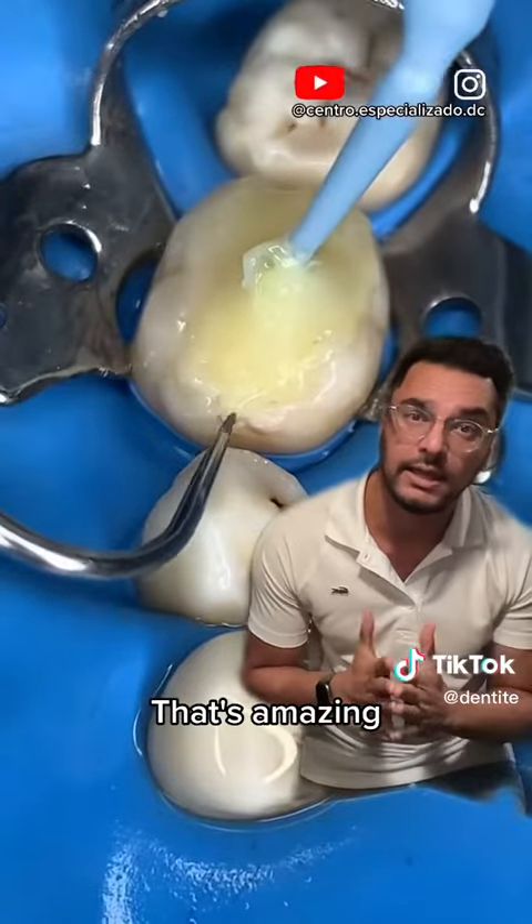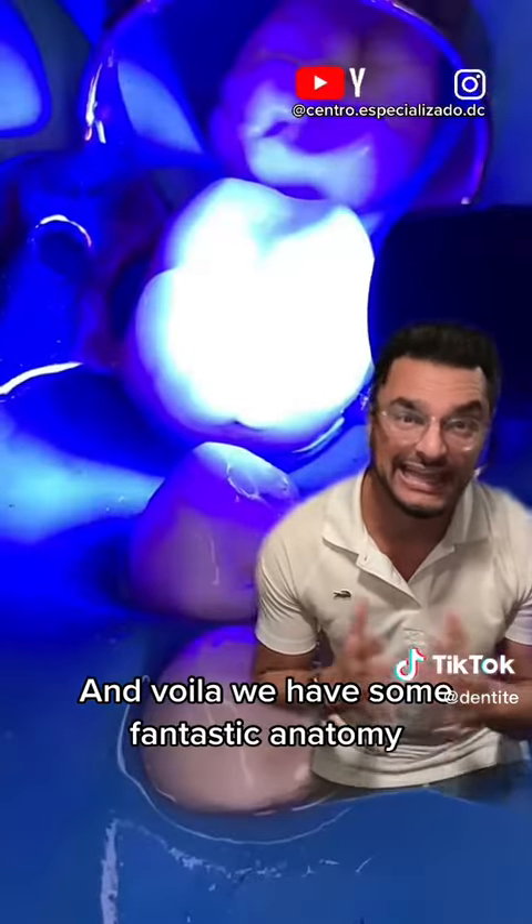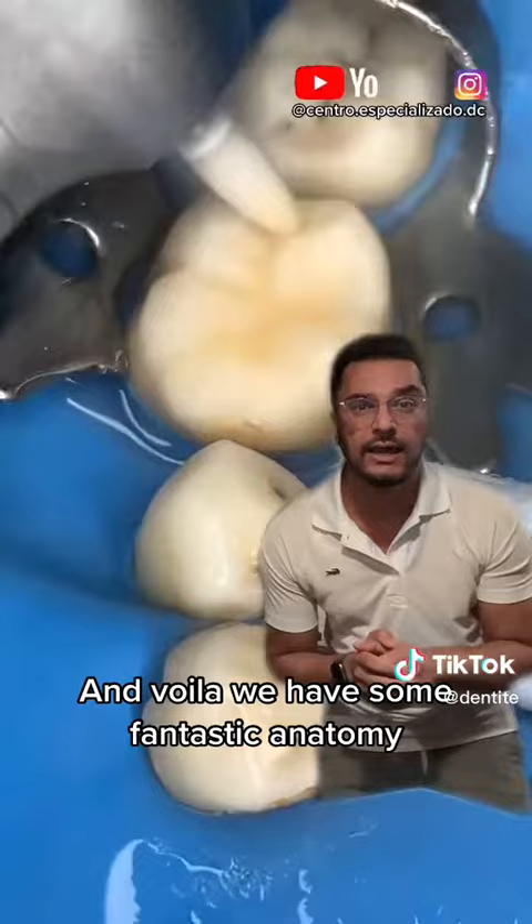That's a brand new tooth. That's amazing. And that's the mold we took from the beginning. And voila, we have some fantastic anatomy.